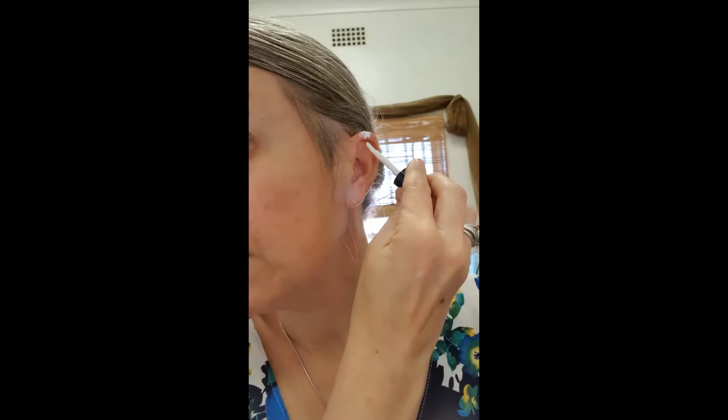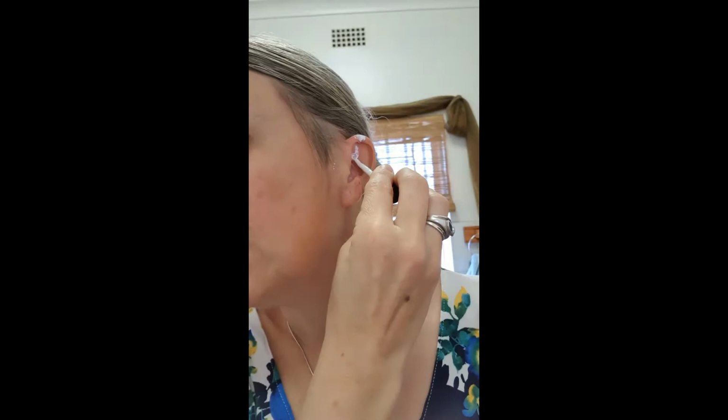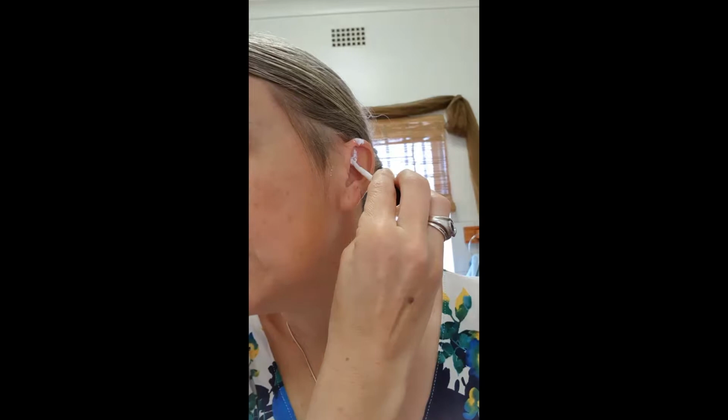Then same goes for, I don't know how clear you can see, there you can see now I've got a problem there. This didn't stick down properly. So this is now going to be quite problematic to convince it to stick down. This happens quite often, so I have to now stop with the latex.